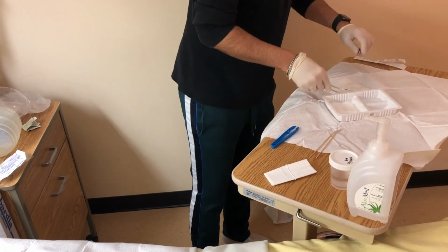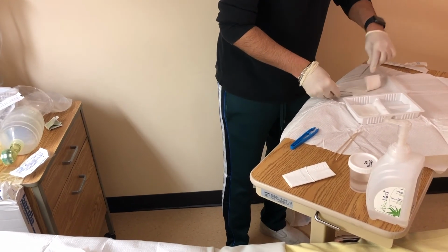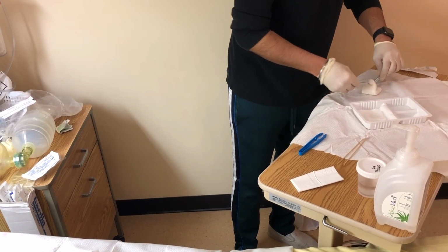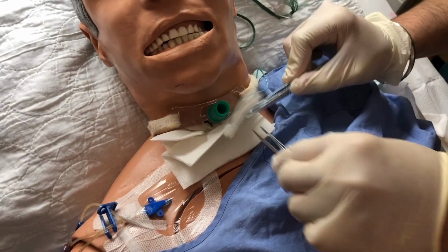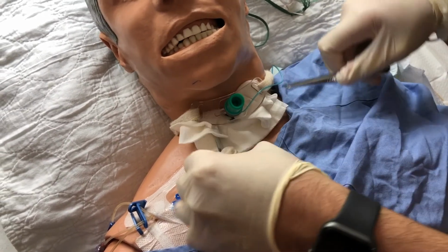And now I would get my dressing. And I would place it there. You want to make sure the part that's touching the stoma is sterile. You can push this up as such, as well as over here.